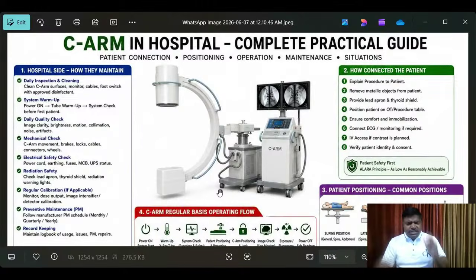Yes sir, if the equipment is not working, they are fearing, because all these things are important. You have to know all things. So I want to show you a little bit. Please try to capture all things.